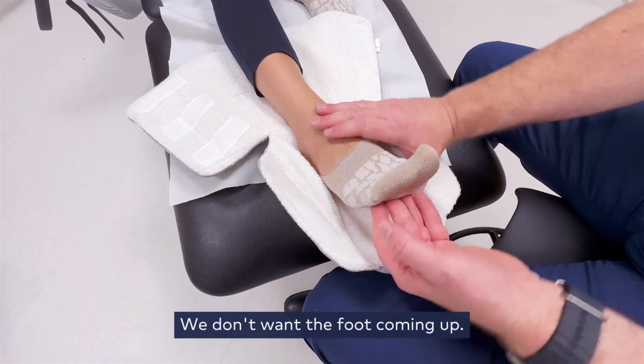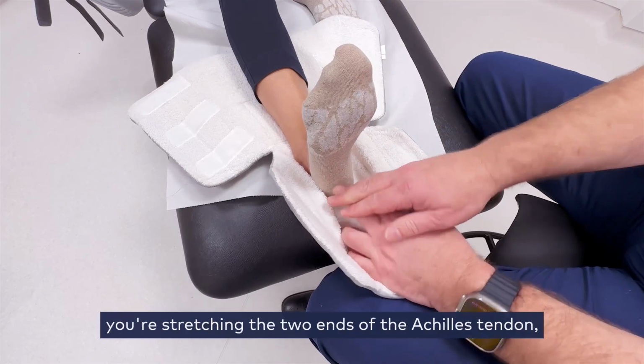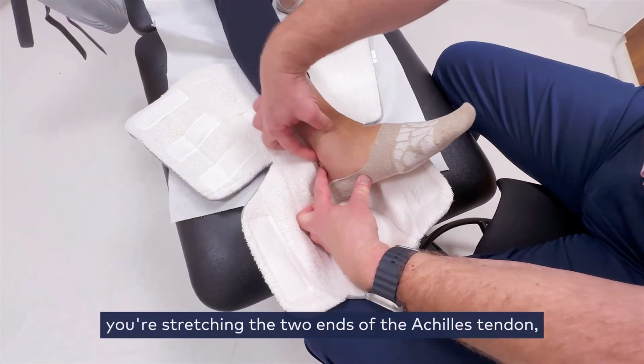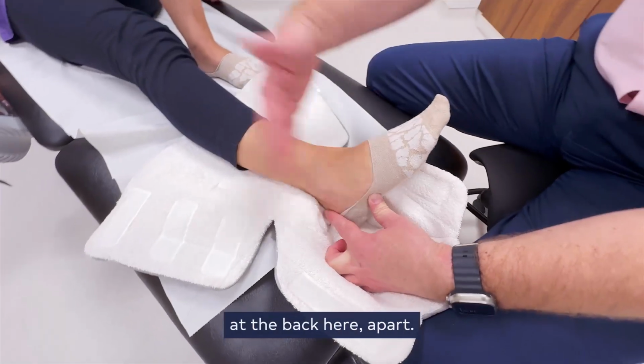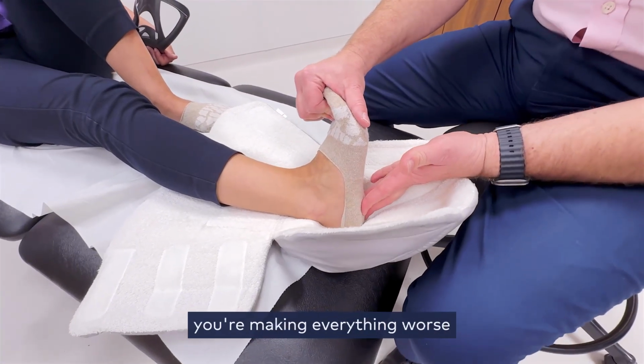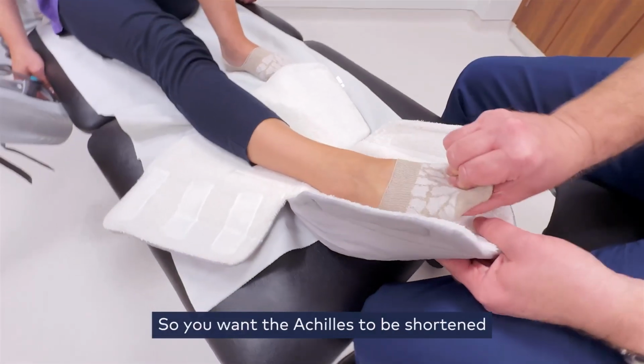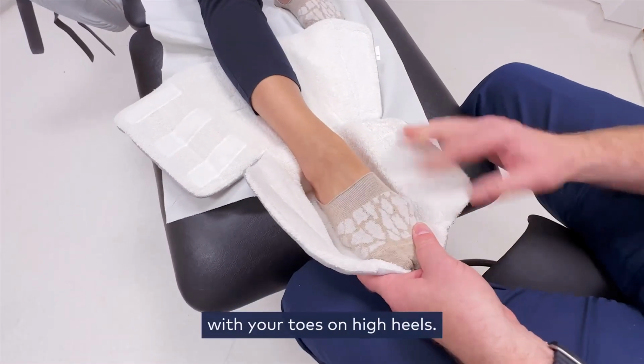Okay, we don't want the foot coming up. If you do that, once you've ruptured your Achilles, you're stretching the two ends of the Achilles tendon at the back here apart. If you bring your toes up above 90 degrees, you're making everything worse and you're stretching the Achilles. So you want the Achilles to be shortened with your toes on high heels.